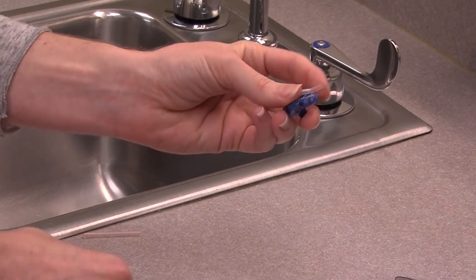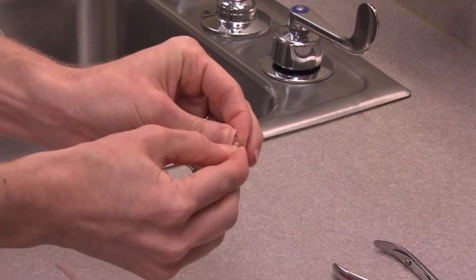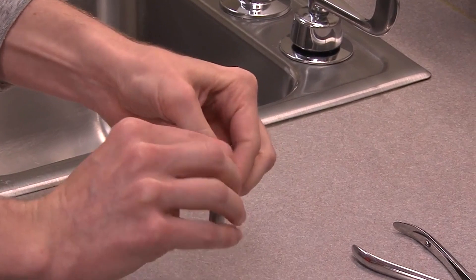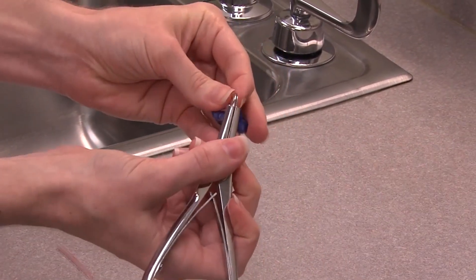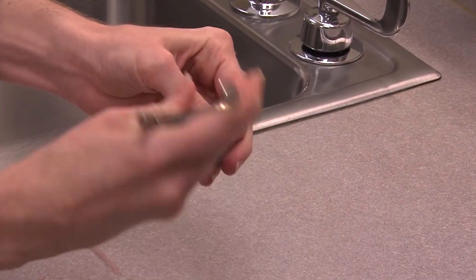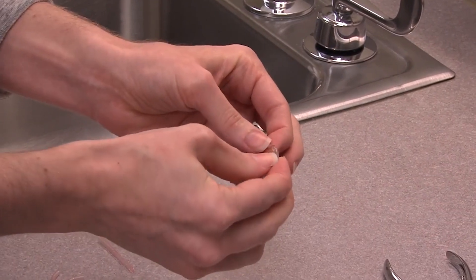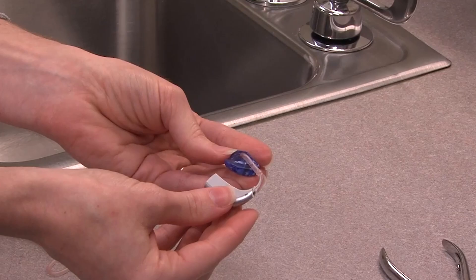Then take the new ear mold tubing and attach it to the hearing aid. If you have difficulty getting it on, you can grab your pliers and widen the tubing. Then reattach it to your hearing aid and you should be set and ready to go.